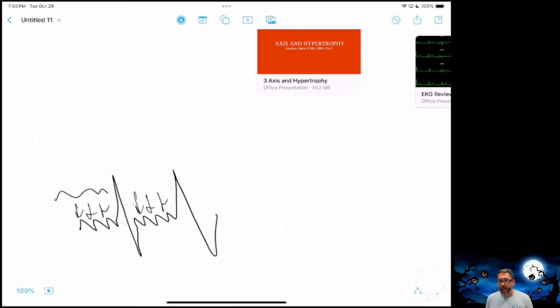The big thing with atrial flutter and atrial fib is really the rate control of the QRSs. The atrium's going to go crazy anyway, but those QRSs, you want to make sure that their rates are controlled. So obviously, if it's 2-to-1, they're going to have a very, very fast heart rate. If it's 3-to-1, 4-to-1, heart rate goes down because it's going to take a little bit before that AV node will send a signal through.